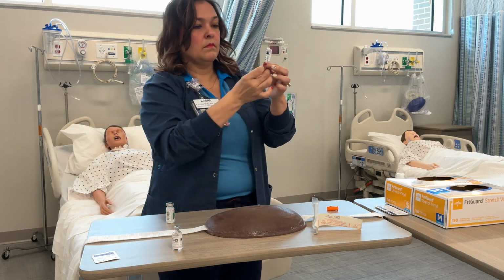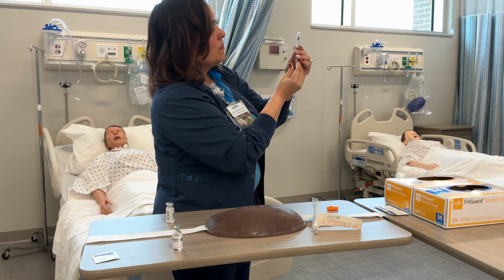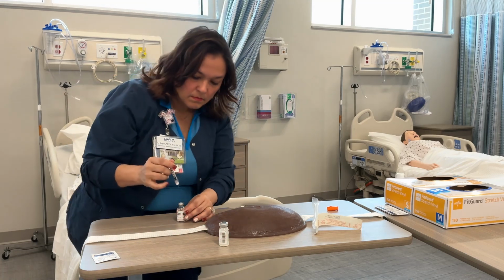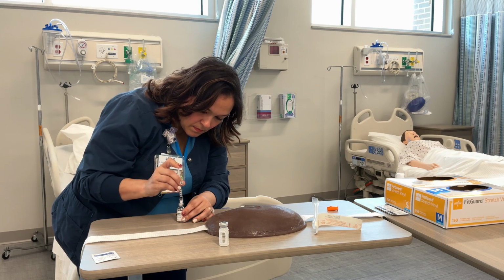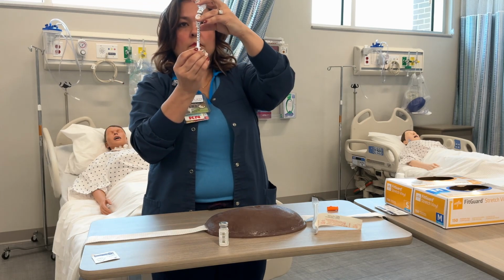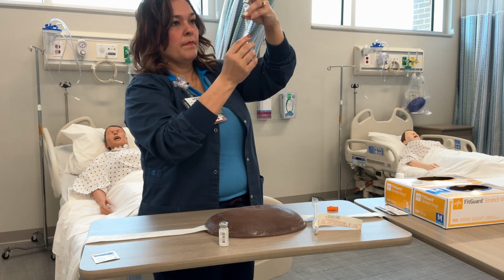Now we're going to pull back our plunger syringe again. We're going to draw up 10 more because we're doing 10 of our regular and 10 of our cloudy. And we're going to inject that into our regular insulin. We're not going to remove the needle. We're going to turn it upside down, and we're going to withdraw our regular insulin. We're going to withdraw 10 units, maintaining sterility.